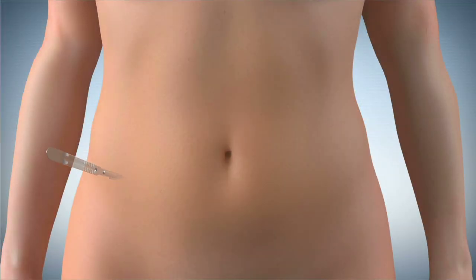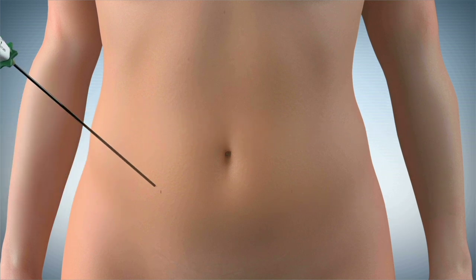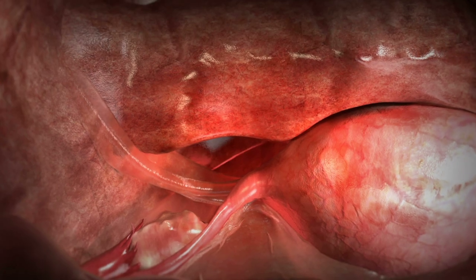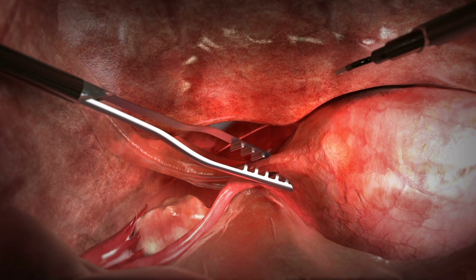First, make a small incision with an 11 blade scalpel. The Minilap device is percutaneously inserted into the abdomen with its integrated needle tip. The device is then deployed to grasp or coagulate tissue.